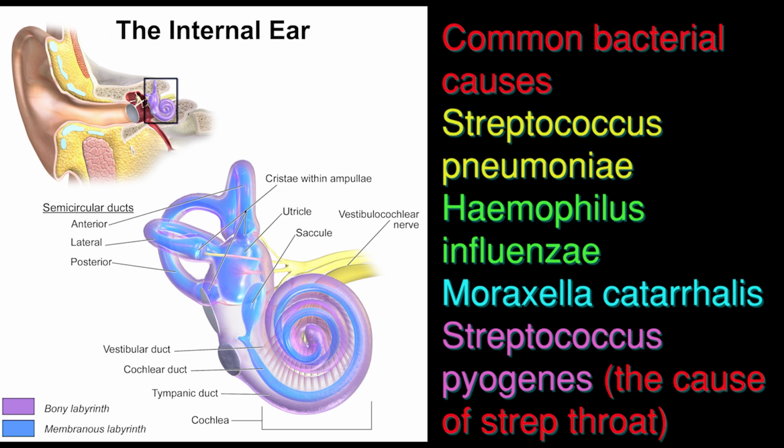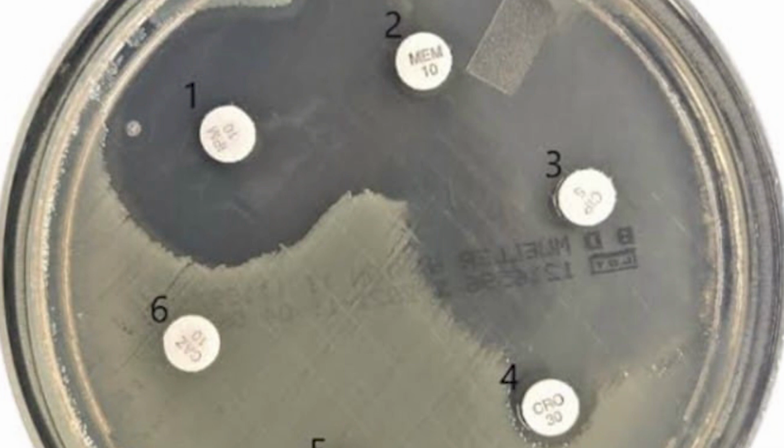For the ear, inner ear, Gram stain is done. Blood agar, chocolate agar, MacConkey's agar, and we can add thioglycolate if prior antimicrobial therapy has been given.